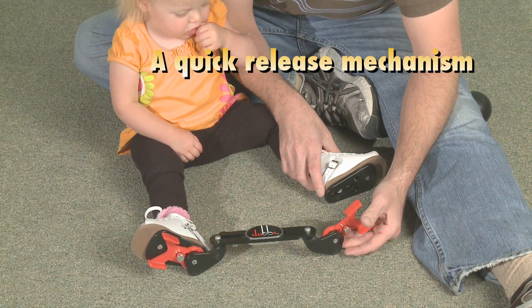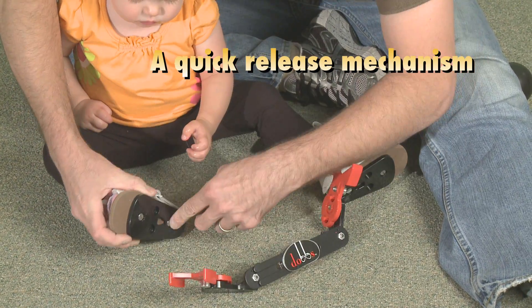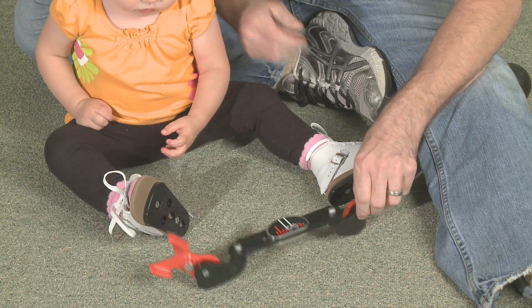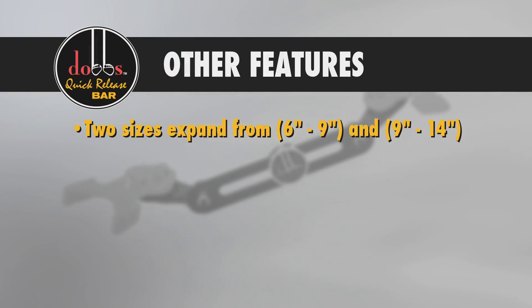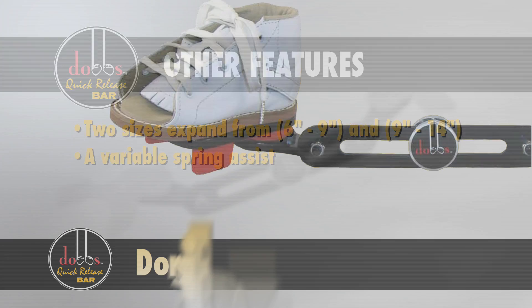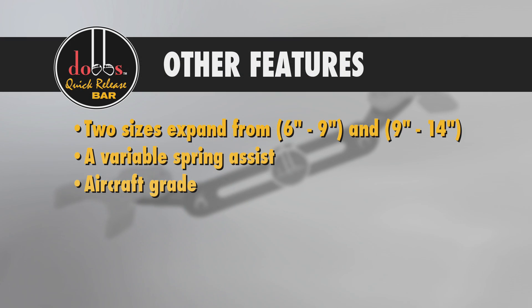The Dobbs Bar is also easy to use, with features that include a quick release that allows the shoes to snap on and off the brace for easy breastfeeding, diapering, car seats, and high chairs. Other features include expansion capabilities, spring assist, and quality construction.